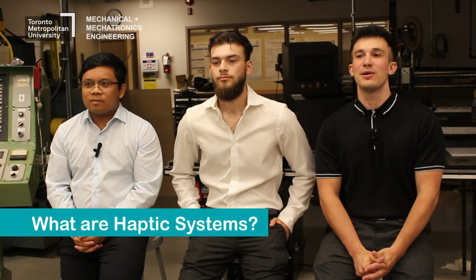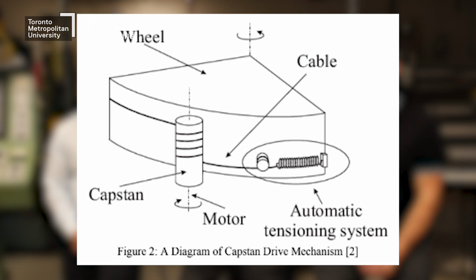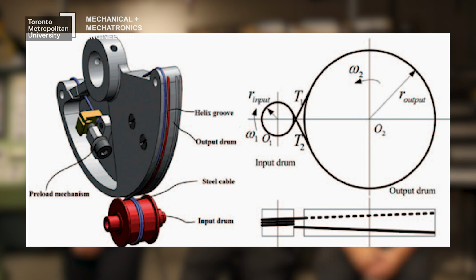So a haptic system, the heart of it is a capstan drive mechanism. Essentially what that is, is a way of applying gear ratio to a motor without having any backlash friction when you backdrive the mechanism. And that's needed because we want to have a completely frictionless and inertialess system for the user when their hand is in it to make it feel as if the device isn't there.